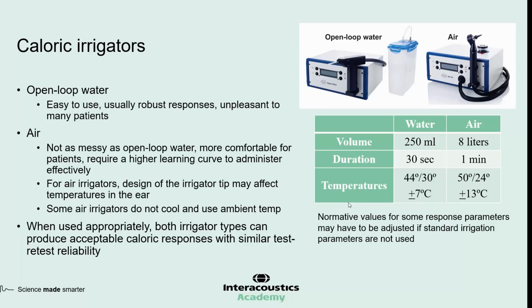Be aware that some air irrigators do not cool the air. They only use the ambient temperature. So if you're in a warm climate, you might not be getting what you think as far as the cool irrigations. This question comes up frequently. Which one is better? Usually whichever one you have experience with, air or water. If you continue using that, if you're comfortable with it, and if you're doing it correctly, both modes of irrigation will generate acceptable results with good retest reliability.